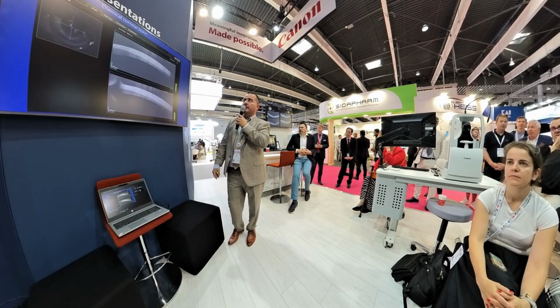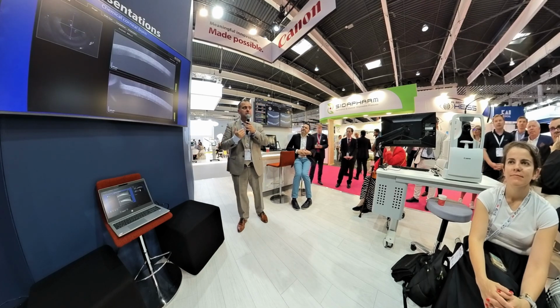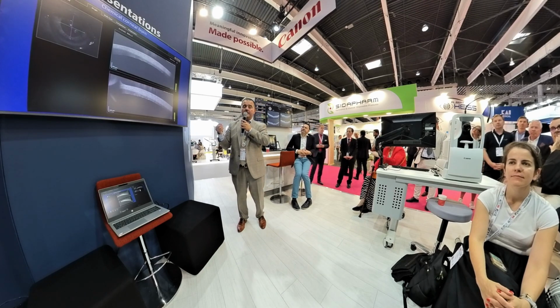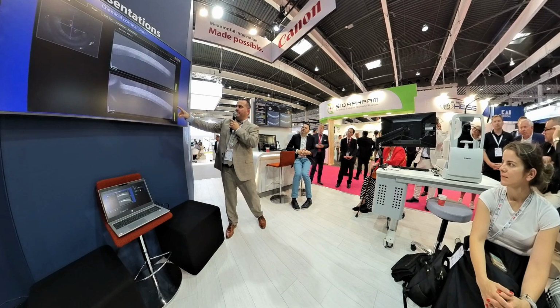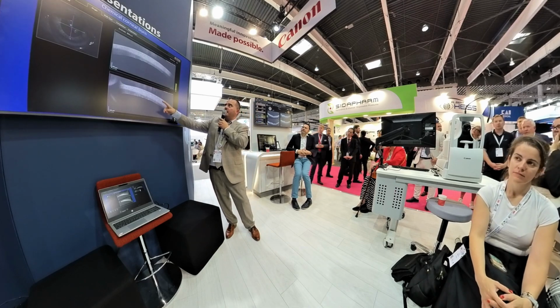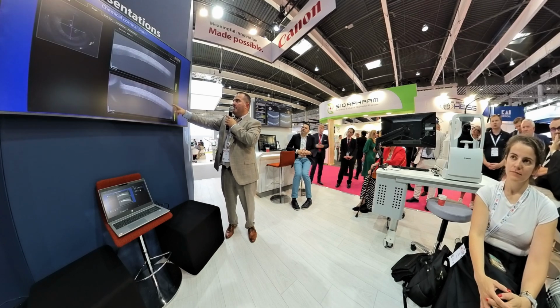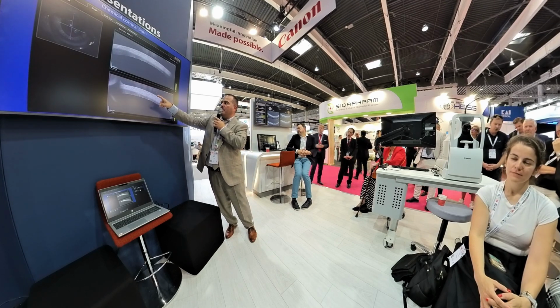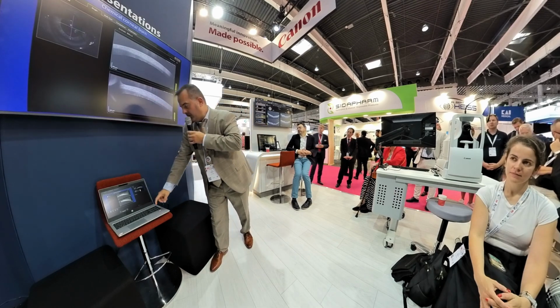And this is an interesting case. Anterior segment is not a vitreoretinal pathology, but this is a case of chemical burn, and it shows really well the structures of the cornea and where is the penetration of the chemical agent, where is the lack of epithelium, where is and how the Bowman membrane is behaving, how the Descemet membrane is behaving.